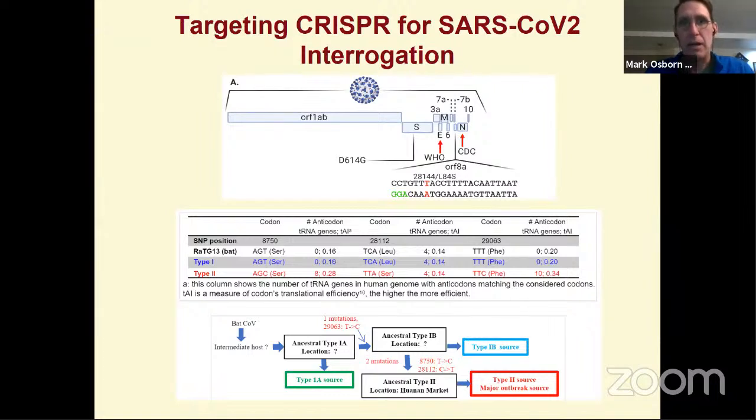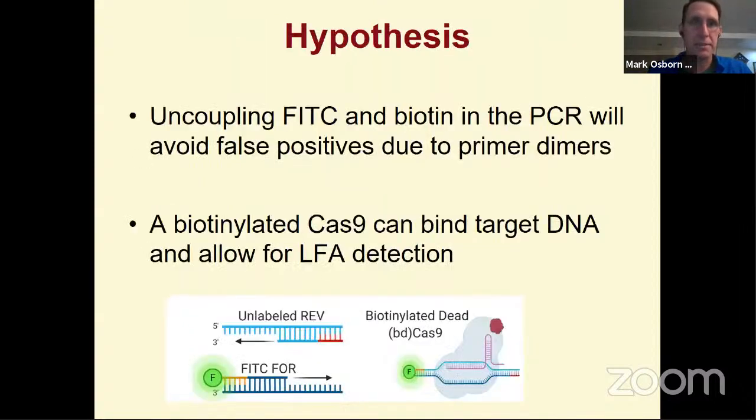And so it would potentially allow us to have a single nucleotide polymorphism resolution for using this specific variant of concern, which was the first variant of concern identified in the United States. And of course, there have been other variants that have now predominated, but the concept was, can we start to differentiate potential variants of concern using this technology?